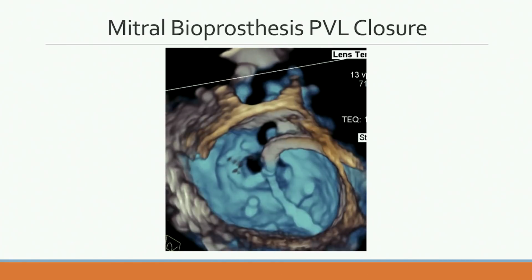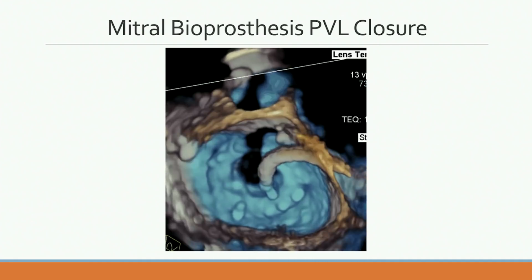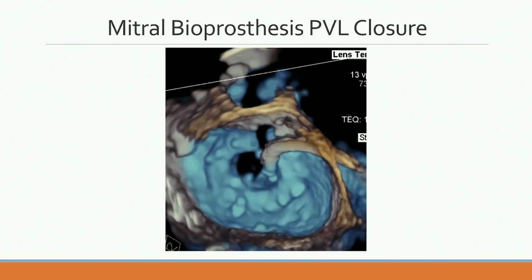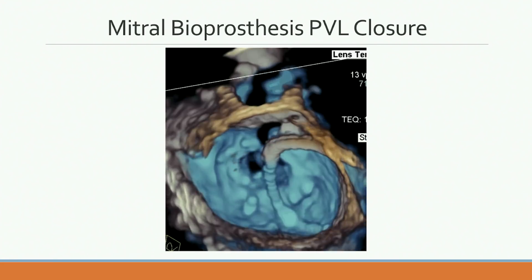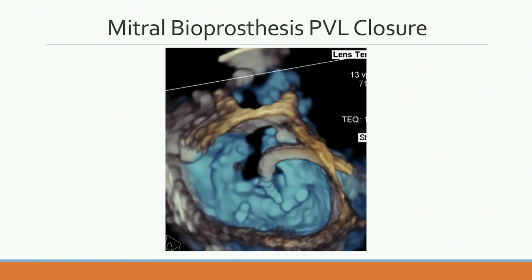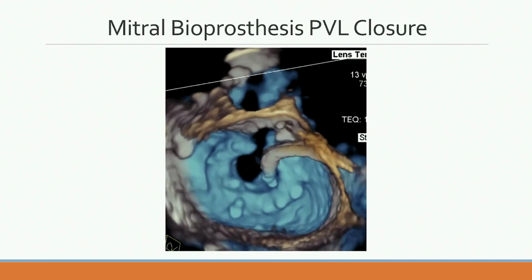Again, we'll recognize that this is a bioprosthetic valve in the mitral position, visualized in a so-called surgical view. And you see that the transseptal procedure has already been done, and that there is a catheter across the interatrial septum, and then through the catheter is the wire, and the interventionalist is trying to pass this wire blindly through the paravalvular leak. Maybe we can help interventionalists and increase the success and ease of passing this wire through the paravalvular leak. How can we do that?